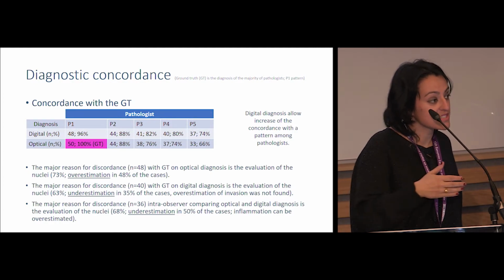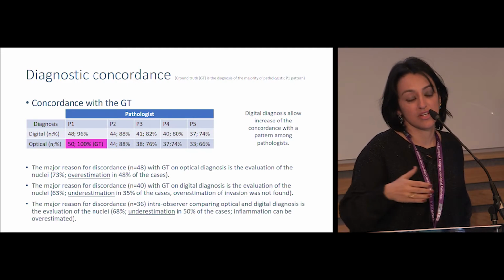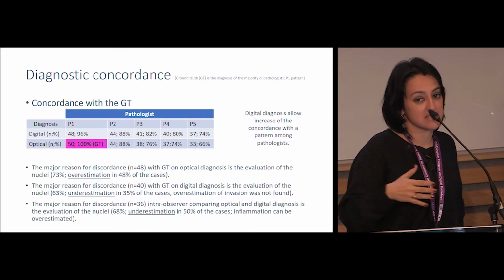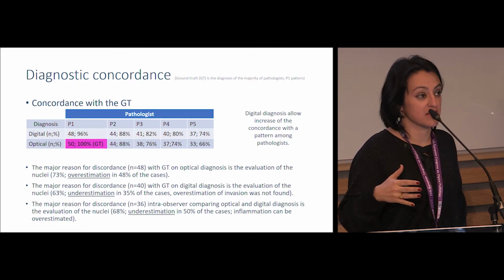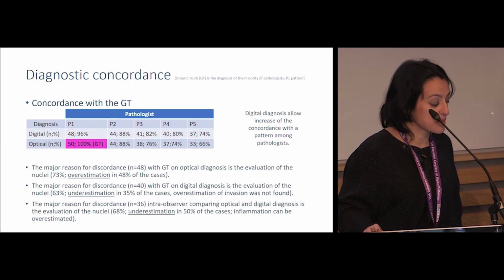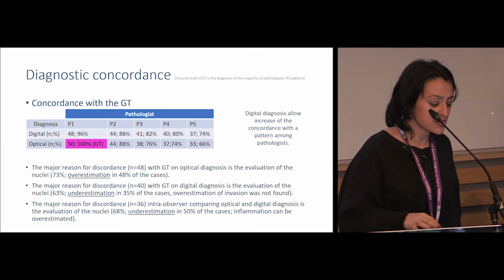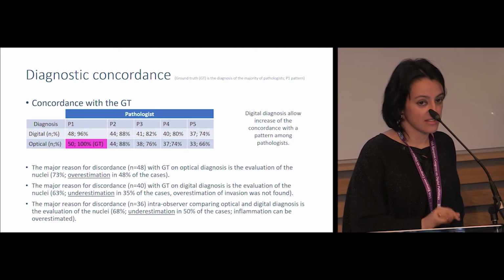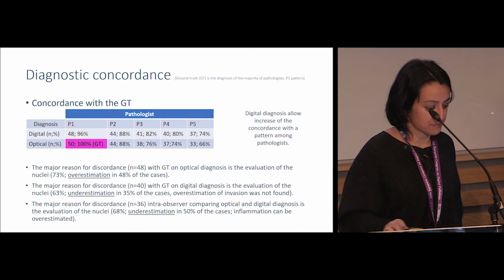And again, probably this is related to the magnification. If you don't go to very high magnification, you miss or you underestimate, which is not necessarily that bad because you can see here they become more concordant. Importantly, there was no overestimation of invasion in this use of digital diagnosis.